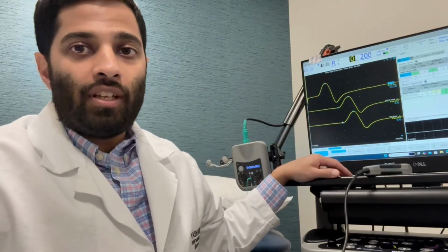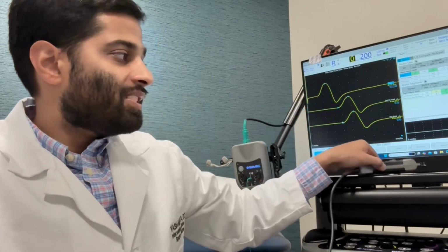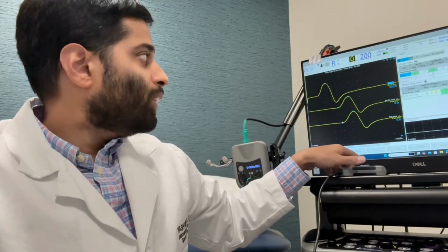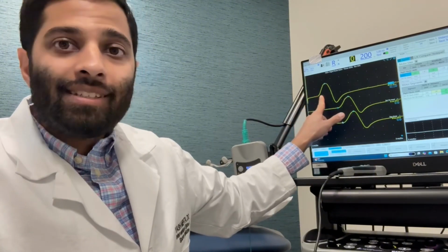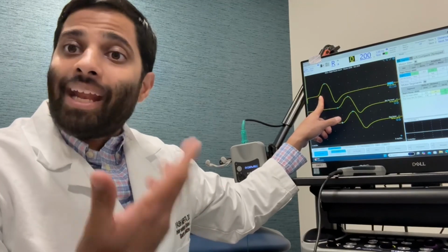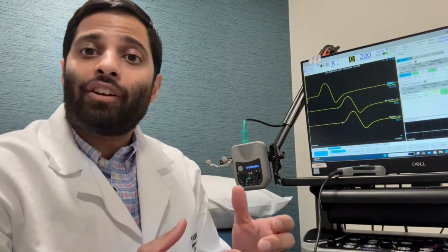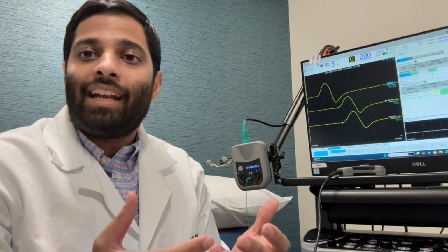The next question is, well, what does the doctor see on the EMG or the NCS screen? And that's a great question. So here we have an example of a nerve conduction study. And what we're looking at, this is actually of someone's leg. But what we're doing is when we stimulate the nerve or give a small jolt, we can see a couple things. We can see how long it takes the nerve to react. So that's the myelination, which shows the speed of the nerve, one aspect of health, and then how much of the nerve, so how robust is that nerve when it does react. These two factors help us really get an idea of the health of the nerves in the legs or the arms.